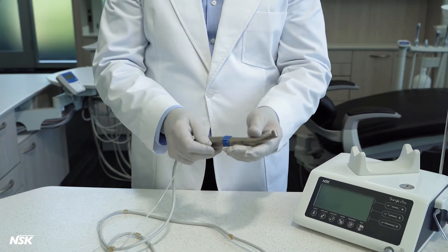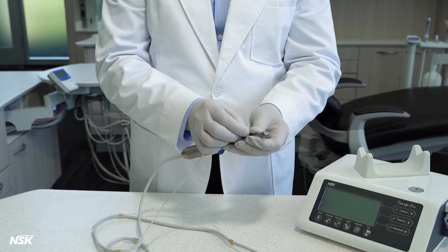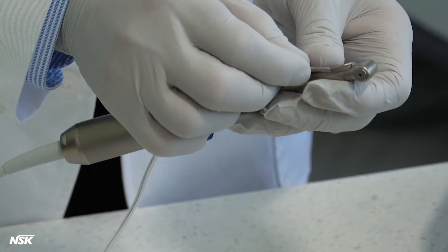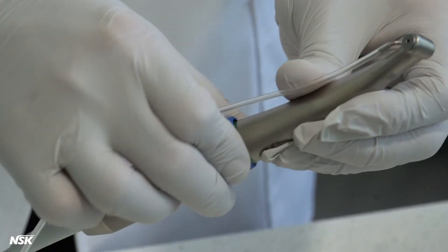There are two ways to connect the irrigation tube to the implant attachment, depending on the type of drill being used in the operation. Single external spray is very common, in which case, connect the end of the irrigation tube directly to the external spray nozzle of the attachment.